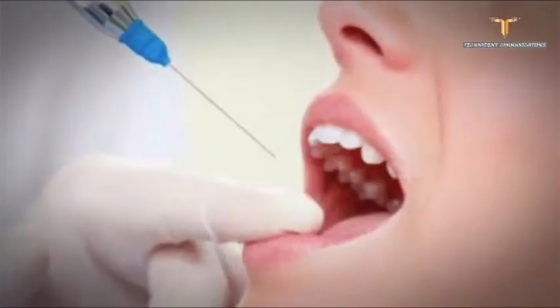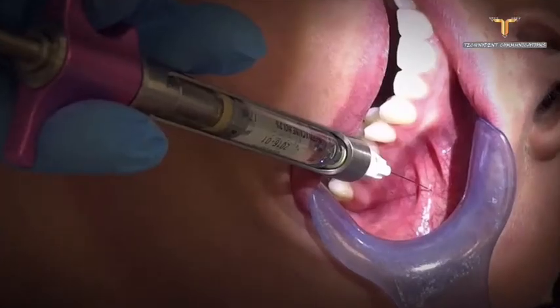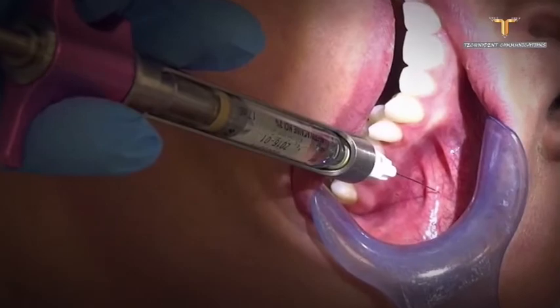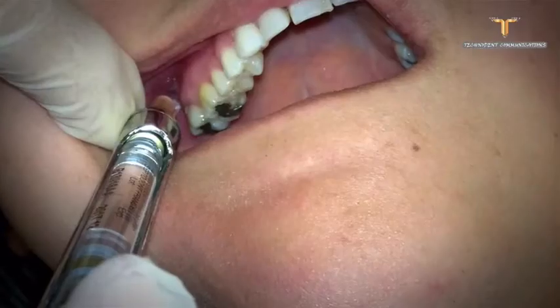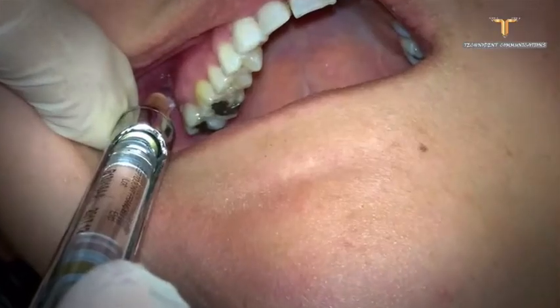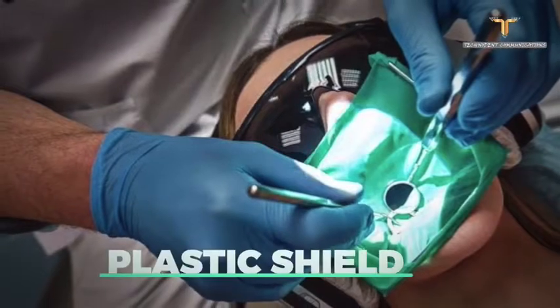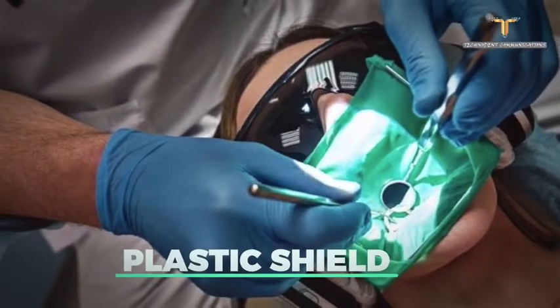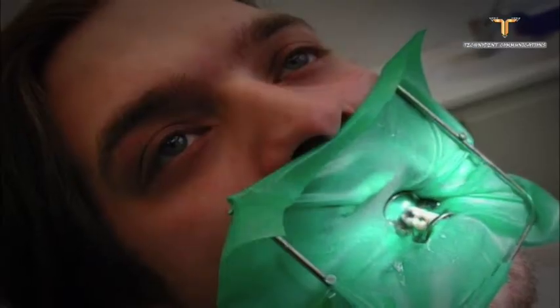When the pulp becomes injured, inflamed, or infected, the pulp is removed, thus relieving your pain or discomfort. To begin with, an endodontist will inject you with local anesthesia to prevent any pain or discomfort during treatment.